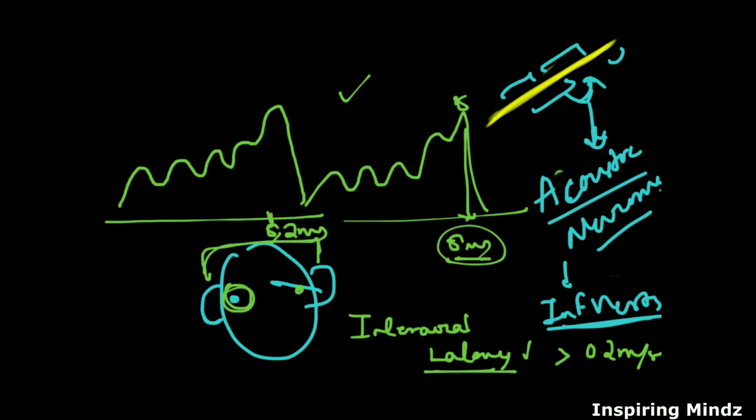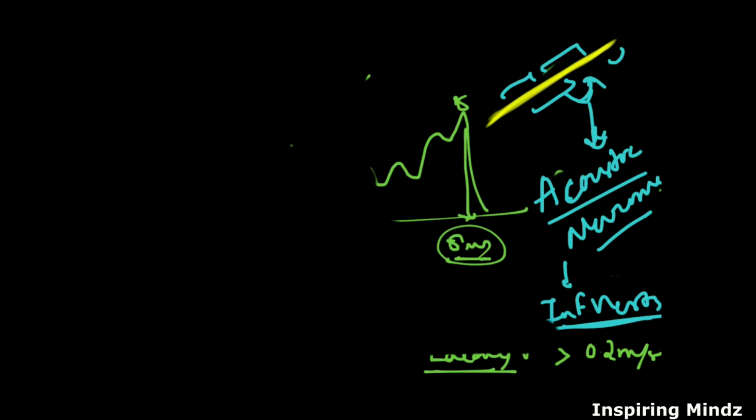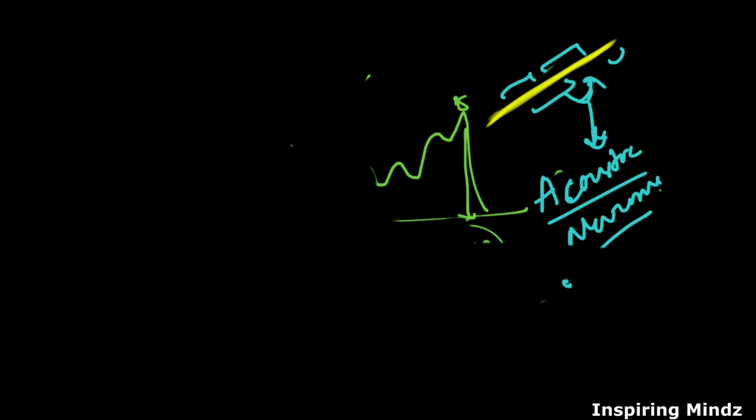Okay, so what are the various ways to interpret BERA? Let's summarize it. First, wave 1 is delayed. Okay, let's write it together. First, wave 1 delayed. If wave 1 is delayed, that means something is present in the cochlea, that is cochlear pathology.